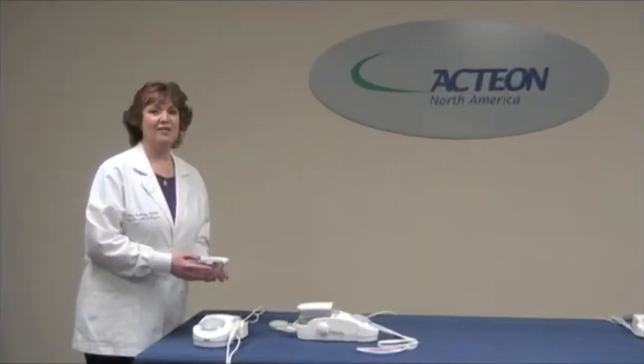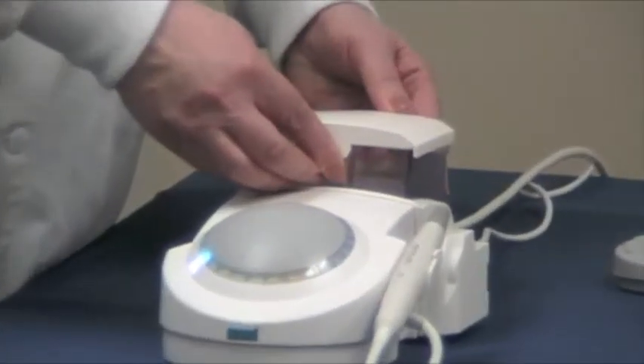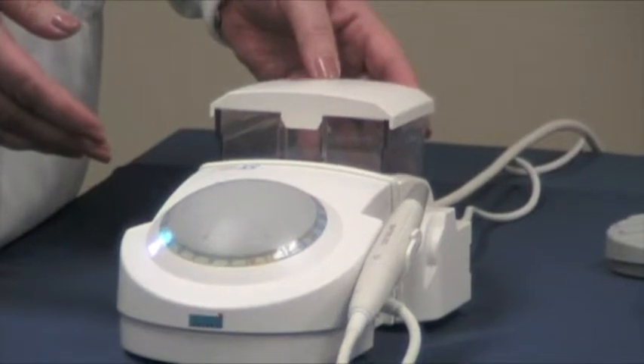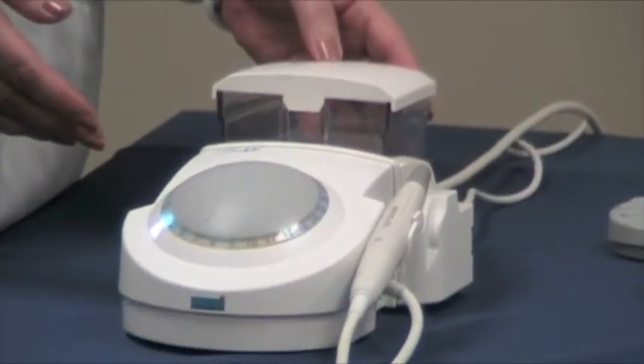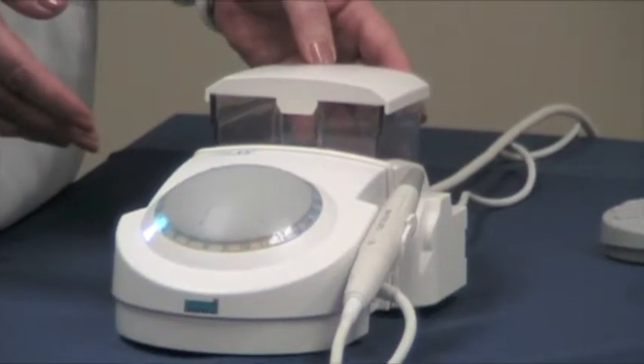Colleen Rutledge here, talking to you now about the P5 Neutron XS — with the same abilities of the P5 Neutron, plus an independent irrigation tank. This large 300 milliliter tank can be refilled during the procedure with no need to unscrew bottles. The tank can use any medicament, such as tap water, chlorhexidine, Listerine, and even sodium hypochlorite for endodontic procedures.